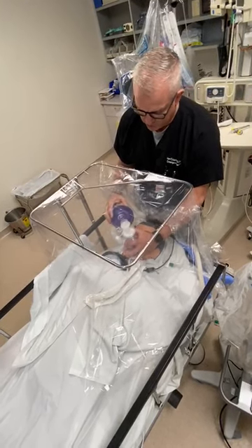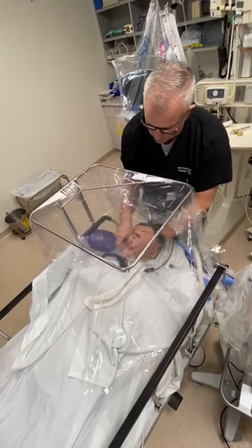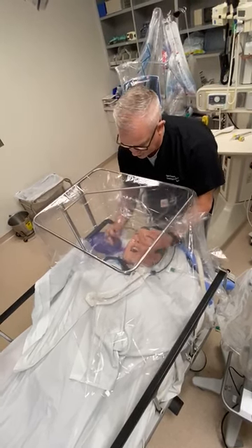You'll notice we do have a filter between our mask and our bag. Once you're ready to intubate, set down your bag valve mask and take out your oral airway.